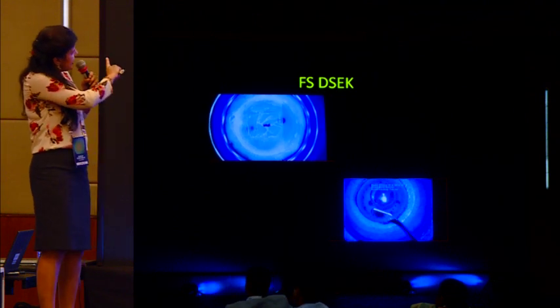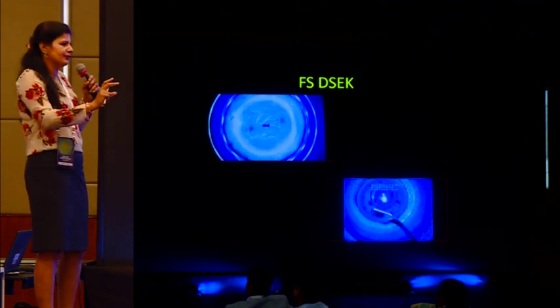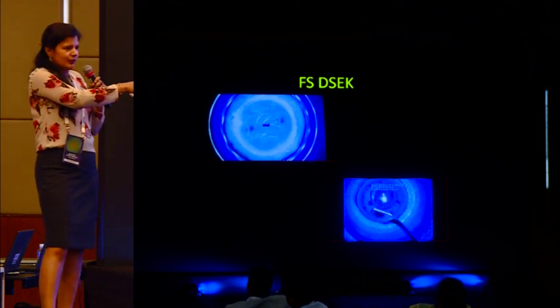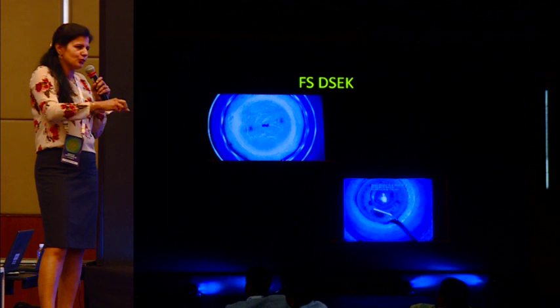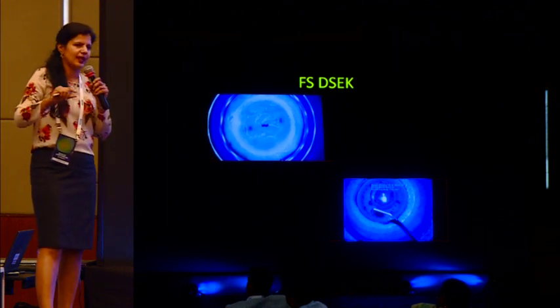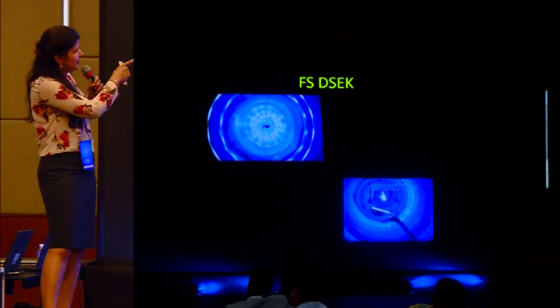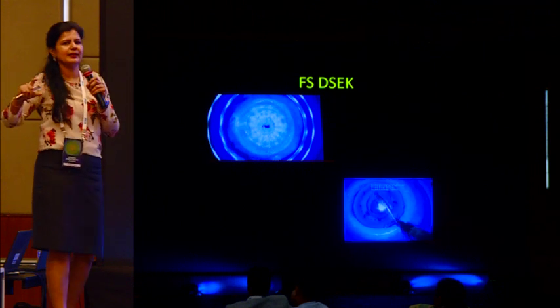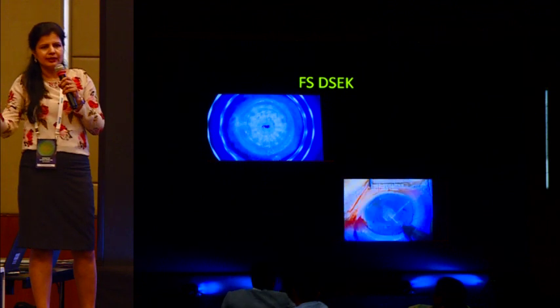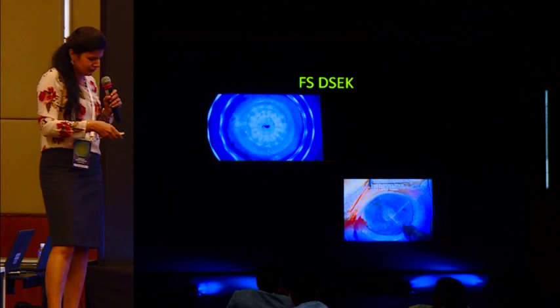And that is very different from the approximately 15 to 20 minutes that you spend doing a dissection with the anterior chamber for DSEK. So this smoothened out the procedure so much, and you get much thinner flaps, thinner corneal lenticules when you do it with the femtosecond laser. Of course, you should keep in mind that the donor corneal thickness may not be exactly what's mentioned in the chart that you get from the eye bank, and you need to keep offsets for that.